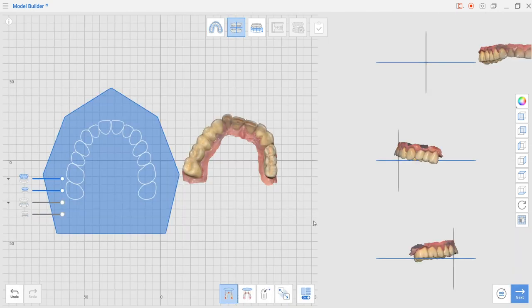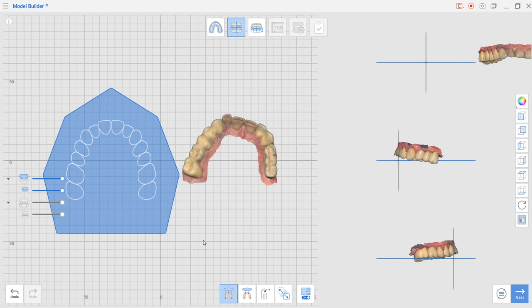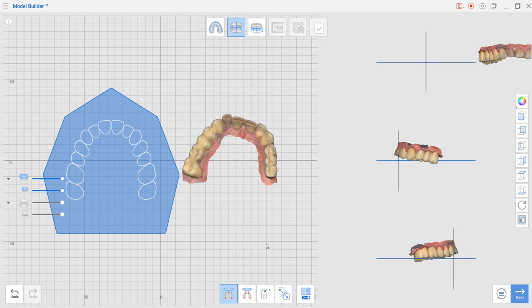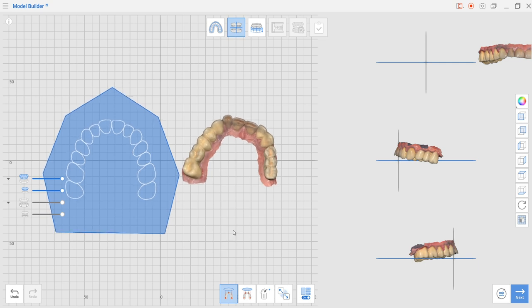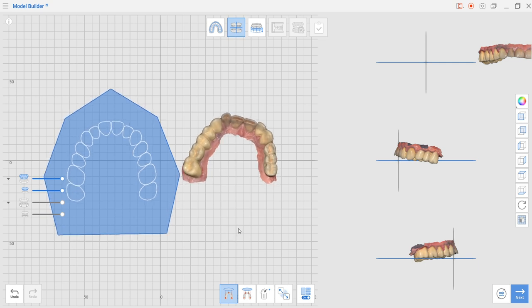As you can see here we have the occlusal plane and it is used for the model builder to generate the height of the bases. They are identical from the maxilla and the mandible and calculated in relationship to this plane. It's not very important to set it perfect but it will take into consideration how much base you build regarding the mandibular and maxilla.